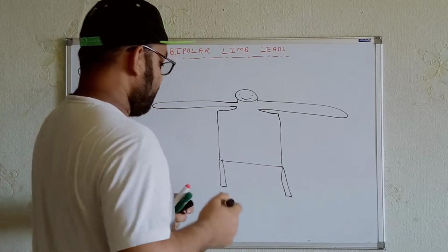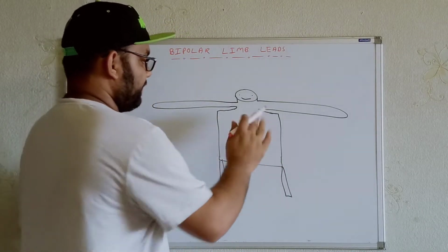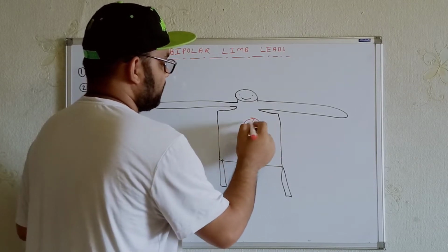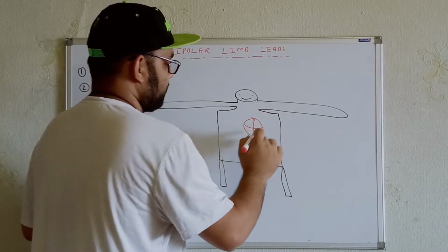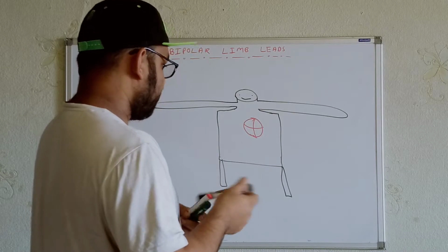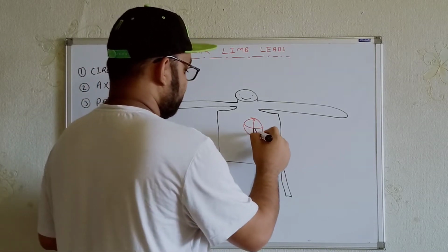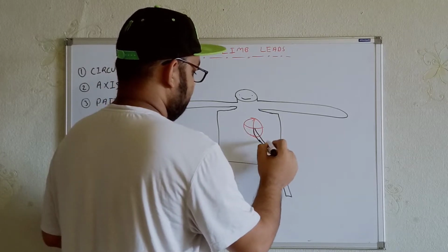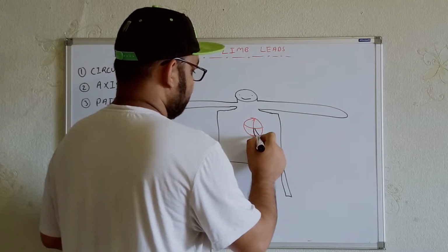Now I'm considering the heart in the middle, where the heart is supposed to be. For example, I'm taking the heart in this position. Now what can we do over here? We know that for the major ventricular depolarization, the vector will go in this direction, left and downward. That is the vector over here.